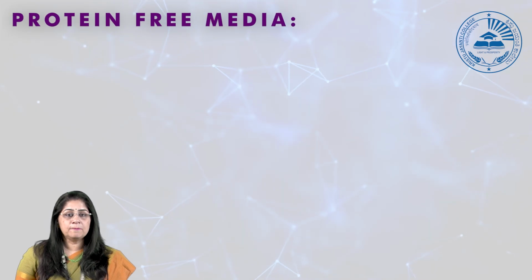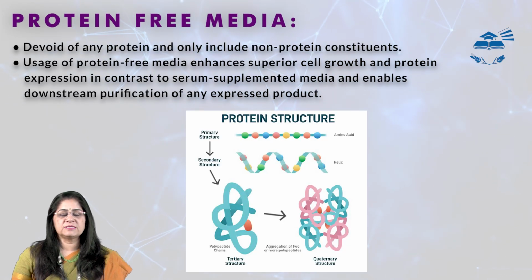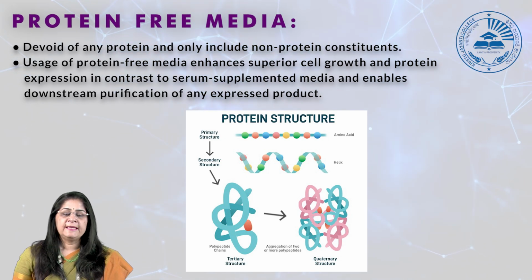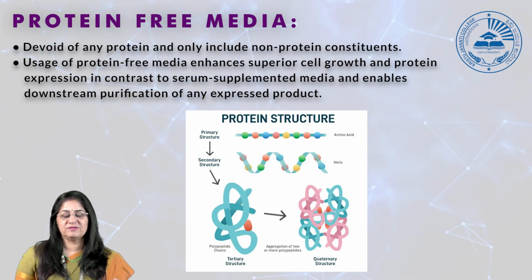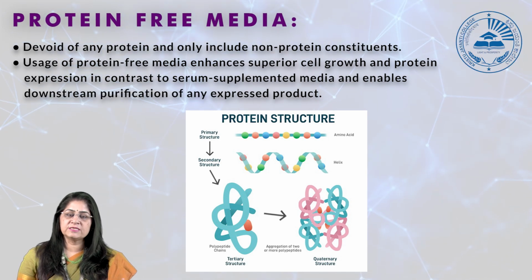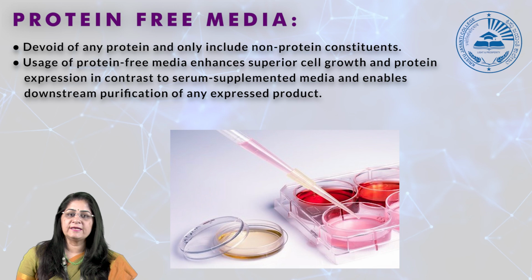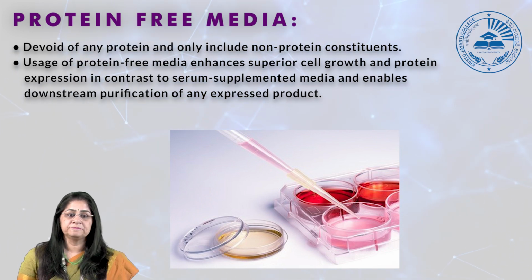Now last one is your protein free media, devoid of any protein, because suppose you want to study, for example, protein expression studies. In that case, it is always preferable to use protein-free media. Otherwise, the protein in the media itself will deviate you. You will not get the right results. This protein will interfere with your protein expression, whichever protein you are targeting.